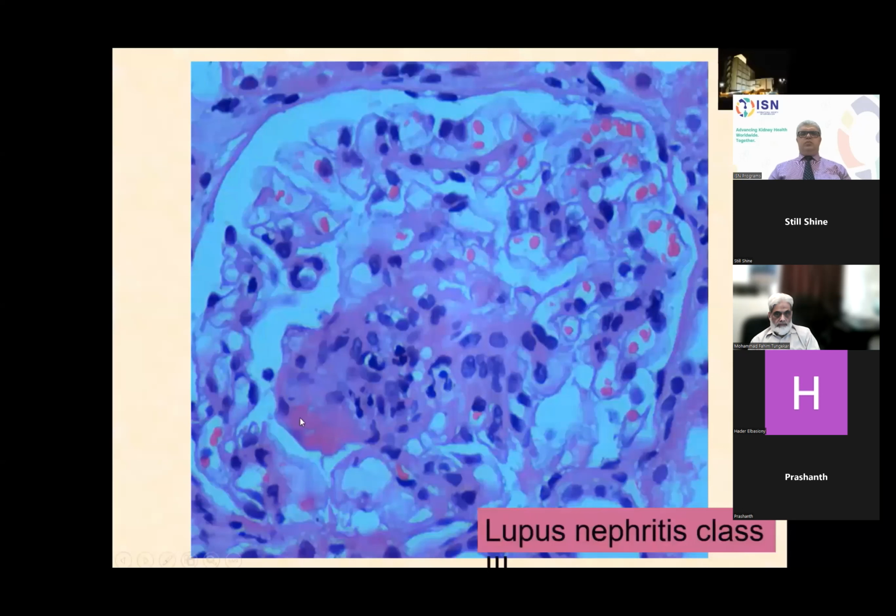And in this segment, we have the severest lesion that could occur in a glomerulus, which is fibrinoid necrosis, a sort of vasculitis. Here, in the fibrinoid necrosis, this is severe nephritis with multiple lesions of lupus nephritis: mesangial expansion, hypercellularity, endocapillary leukocytic exudate, and fibrinoid necrosis with karyorrhexis or fragmented nuclei of the mesangial cells.